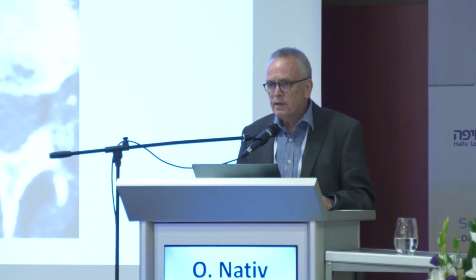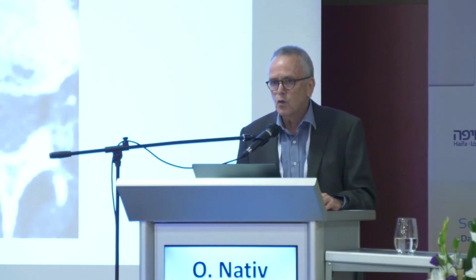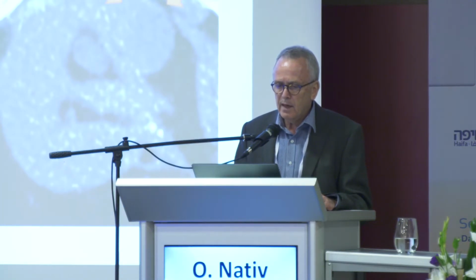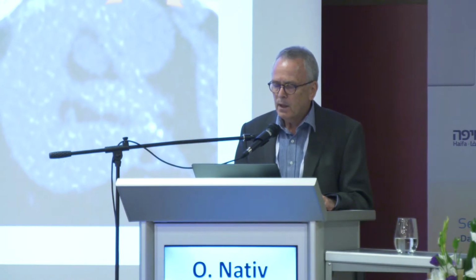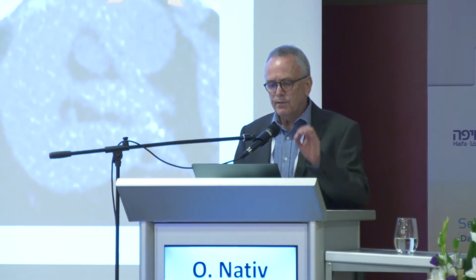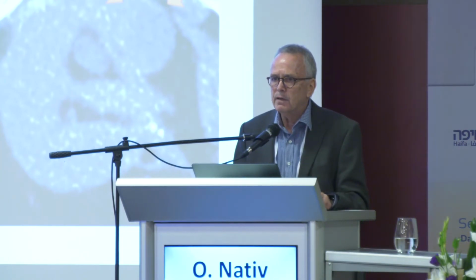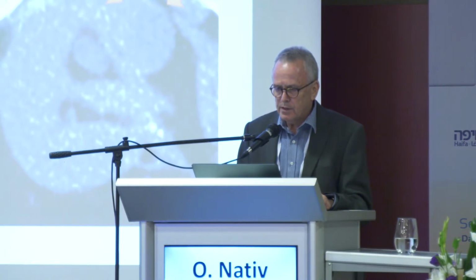Now, we are not anymore treating only the classical lesions. You see a small posterior peripheral lesion. This is what we did in the past. But today, we're willing to take some more challenging cases. Look at the left. This is ablation of RCC in a transplant kidney. Look at the middle. The tumor, which is completely endophytic, was relatively large. So pre-treatment embolization reduced the size and enabled perfect freezing. We are also willing to treat a small hilar tumor, as you see on the right.